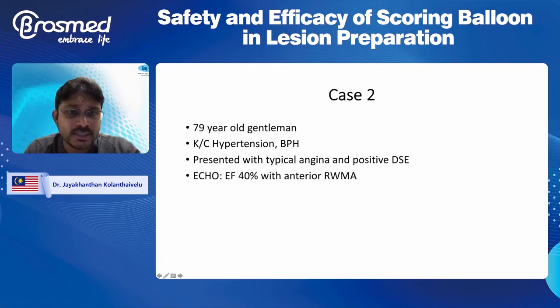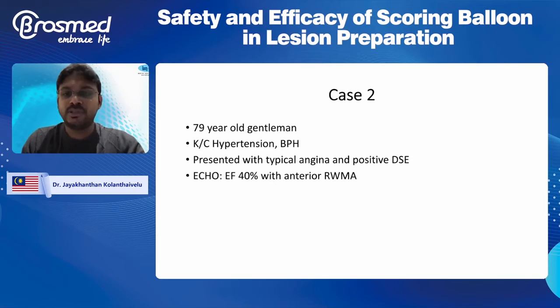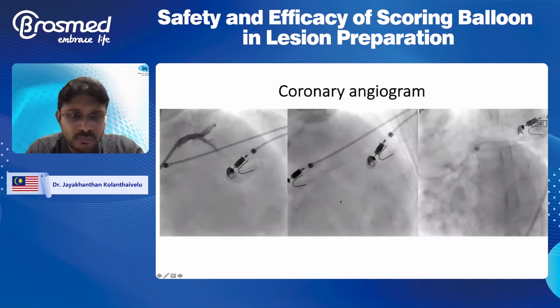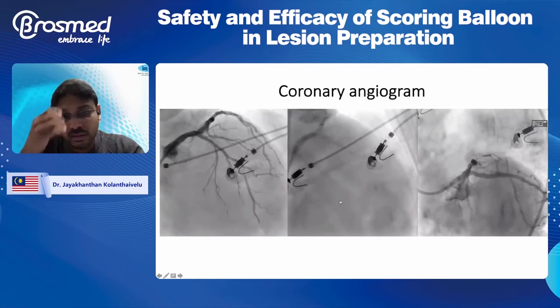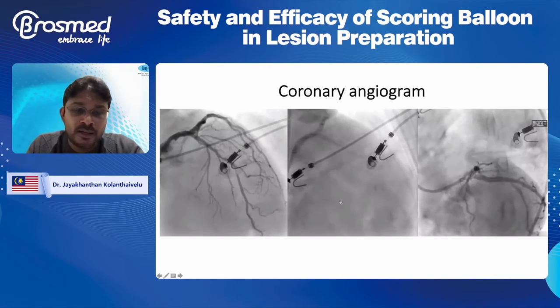Now, second case, a 79-year-old gentleman, hypertensive, also has some prostate issues, came in with very typical angina and a positive dobutamine stress echo. Echo shows an EF of 40% with anterior wall motion abnormality. So this is the coronary angiogram. If you may appreciate, there's quite a bit of calcium in the proximal LAD running up to the mid LAD.